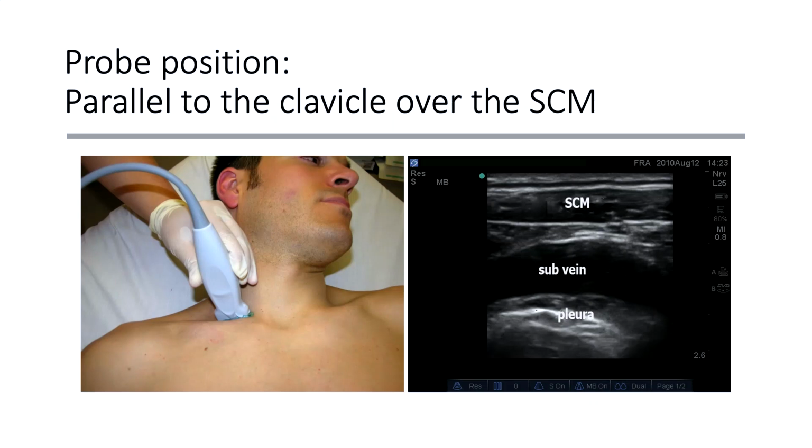You know that both would be hyperechoic lines, but one would be more superficial than the other, the first rib, and that more superficial line will project an acoustic shadow. So that way, you will recognize the first rib as such. So you will label it and say, this is for sure the first rib, as opposed to just going directly and saying, oh yeah, there is the first rib.